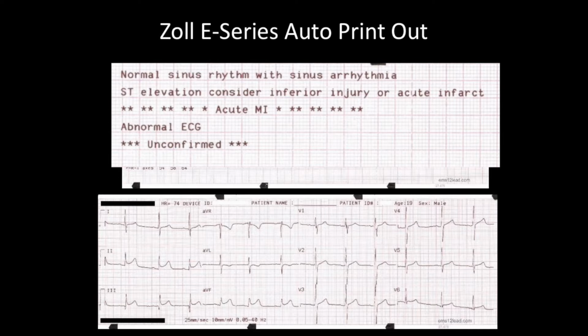Are we only transporting to, like you said, in Colebrook or, you know, other towns? Would we, if the health center is the closest facility, that needs to be a consideration, would we transport for a physician to look at it at the health center, or are we only transporting 12 leads to Charlotte?